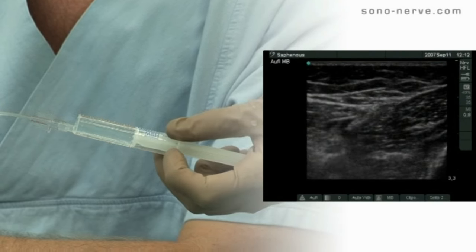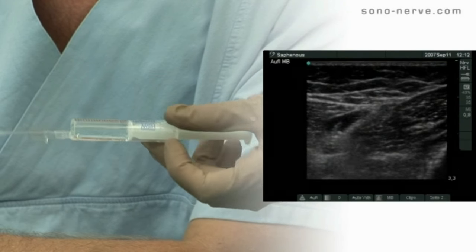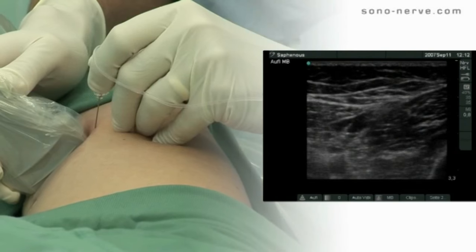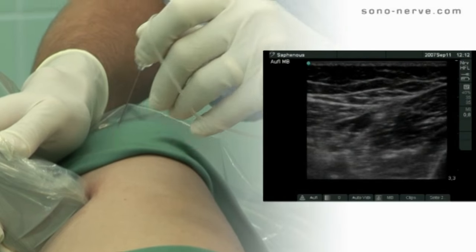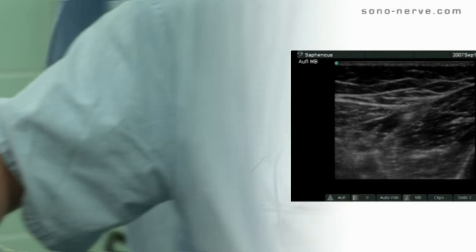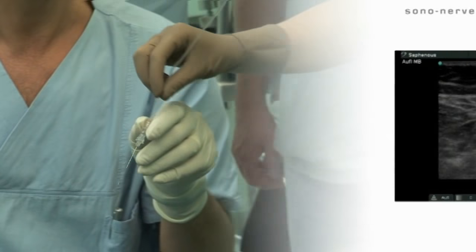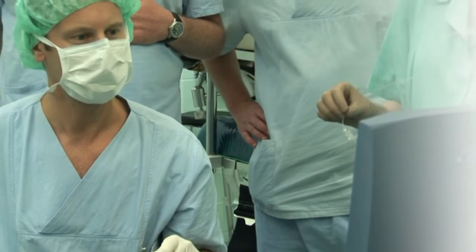The use of ultrasound is particularly convenient as the saphenous nerve is a purely sensory nerve and is not amenable to blockade with a nerve stimulator if muscular contractions are sought.